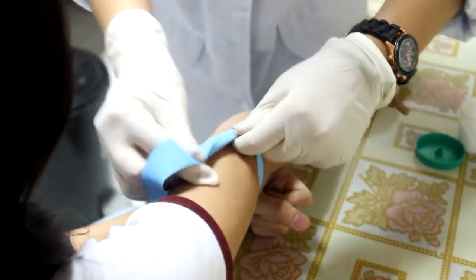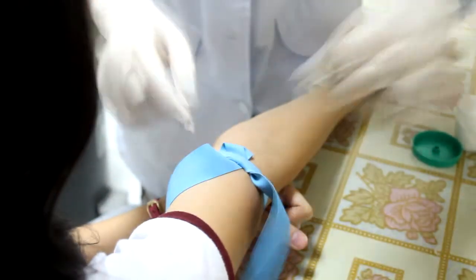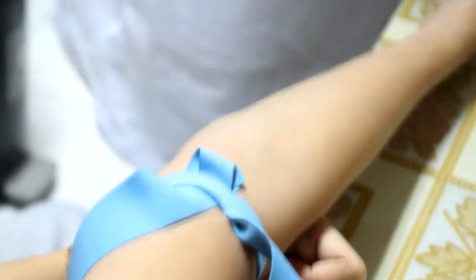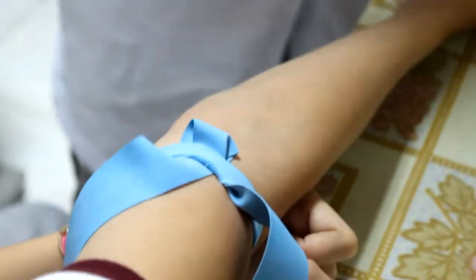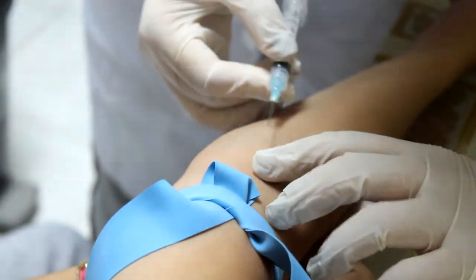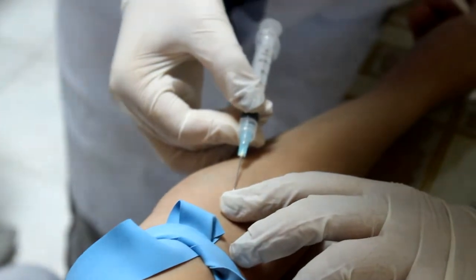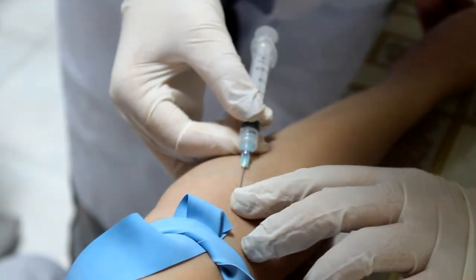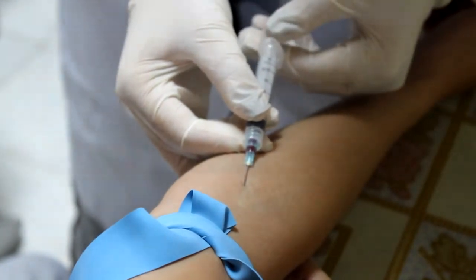With the thumb of your free hand, pull downward from below the intended puncture site to anchor the vein and tighten the skin. Holding the needle in line with the vein and with the bevel up, insert it through the skin at a 30-degree angle or less until you perceive to be in the center of the vein or until a flush of blood is visible in the hub.